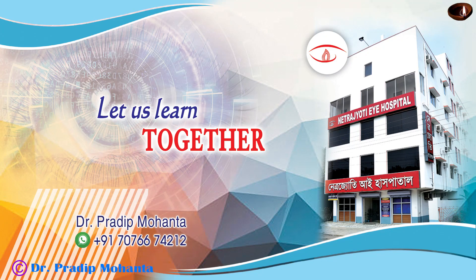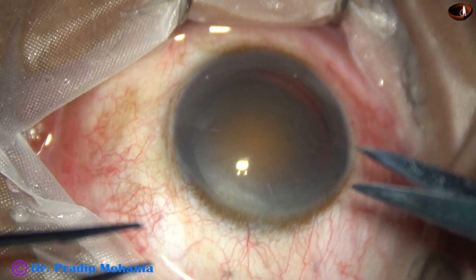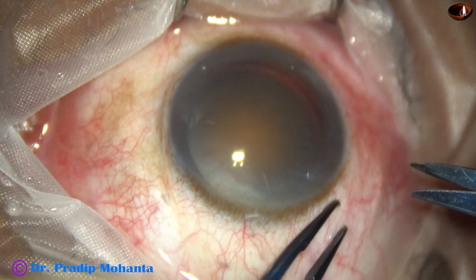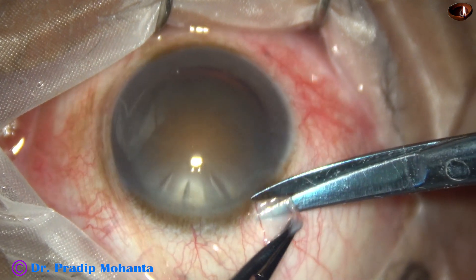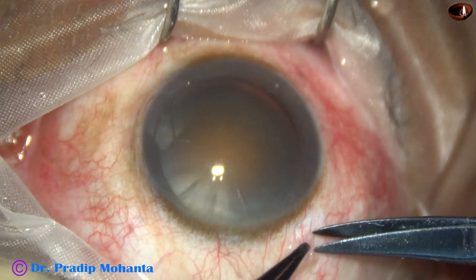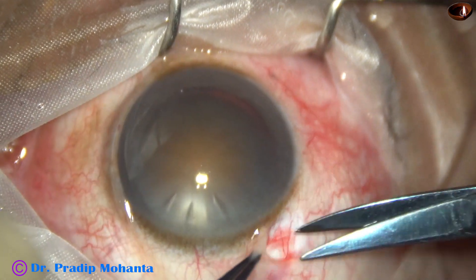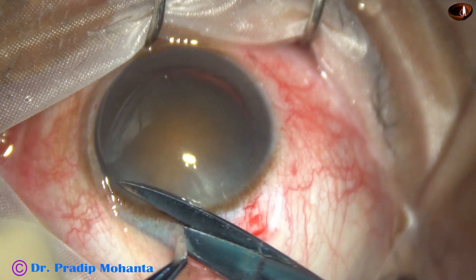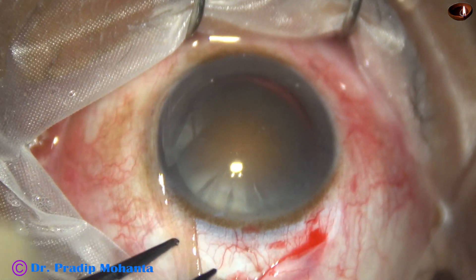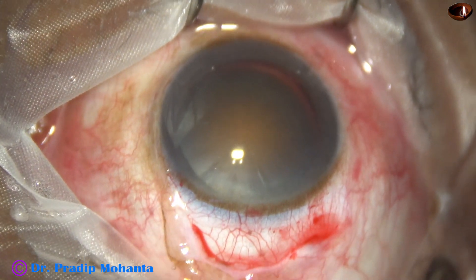Friends, welcome to my workplace for Hands-On FACO and SICS training. This is a one-eyed patient. This is the only seeing eye and he has this hard cataract. I have done harder cataracts with FACO emulsification technique in many cases, but this patient has only one eye and I could not take the risks of FACO emulsification in this case.